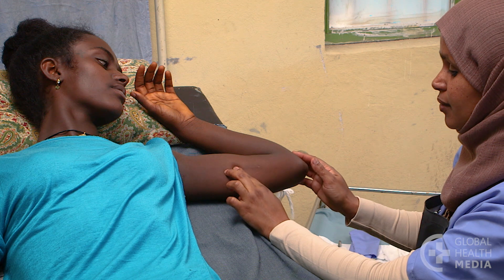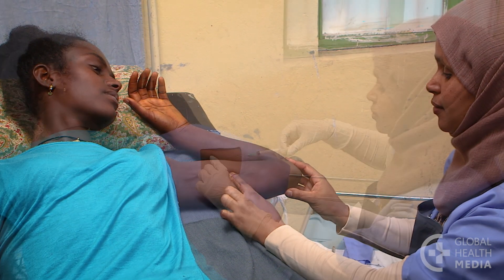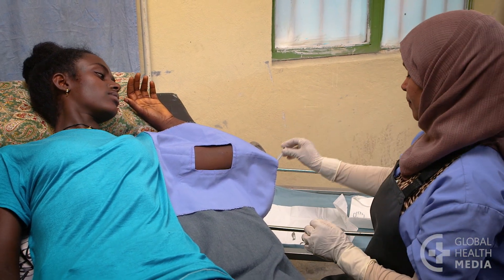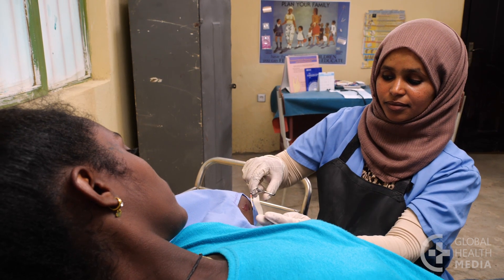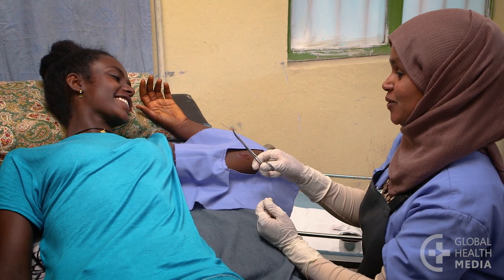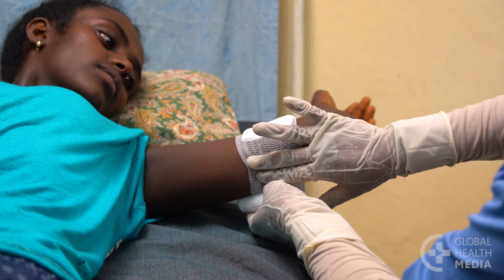Removing the implant is usually quick and easy too. The health worker will numb the area just under the end of the implant. As before, it stings a little, but you won't feel any pain. Then she makes a tiny cut in your skin and pulls out the rod. If you want to continue using the implant, another one can be inserted in the same incision at that time.